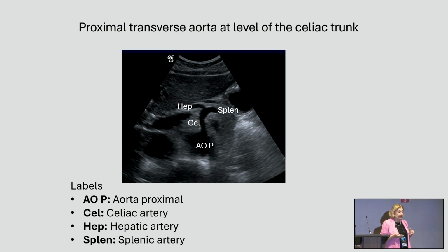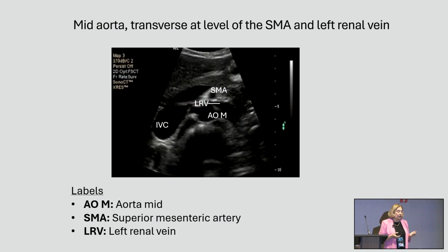If I said, where in a lab are we going to call proximal? Let's say at the level of the celiac. Maybe it's above the celiac, so you have to go past the celiac. But the most important thing is that everybody agrees. Sometimes you can't get above the celiac. So we say not just proximal, mid, and distal, but what are we calling those areas? How will we define them?